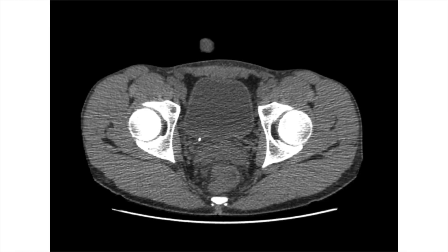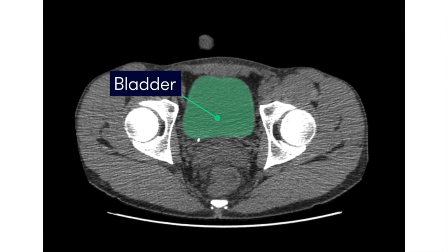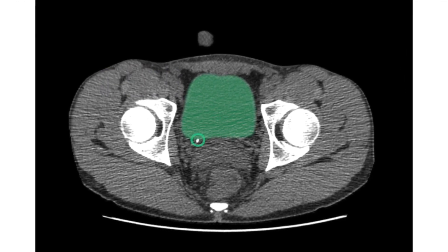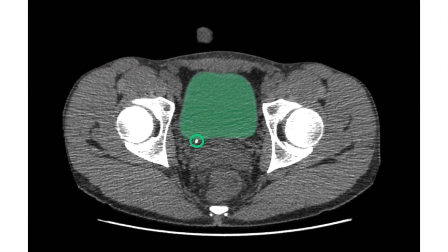Looking at this other CTKUB image, we can see the bladder sitting anteriorly, and posterior to this — positioned below it on the scan — we can see a urinary tract stone that's become lodged at the vesico-ureteric junction, or VUJ.